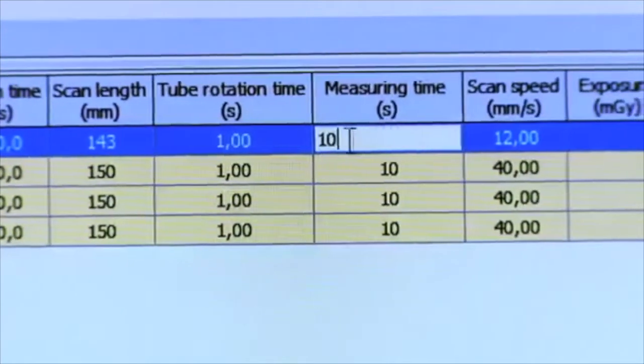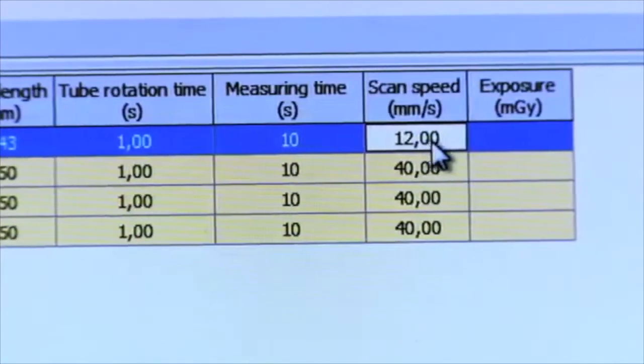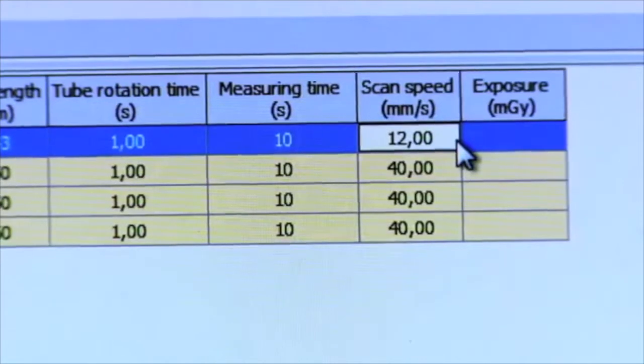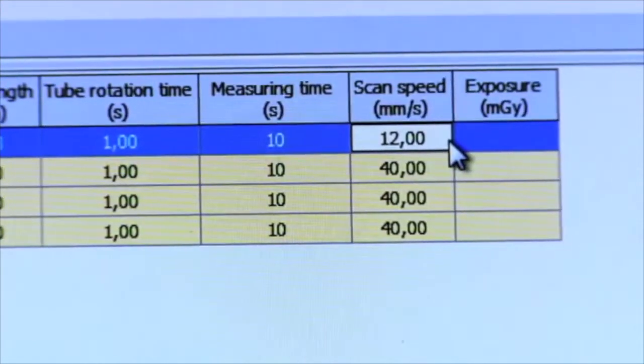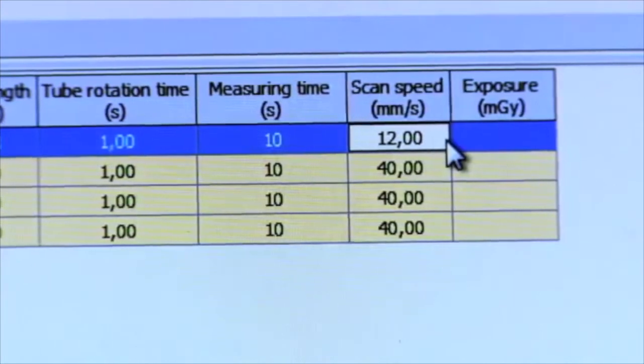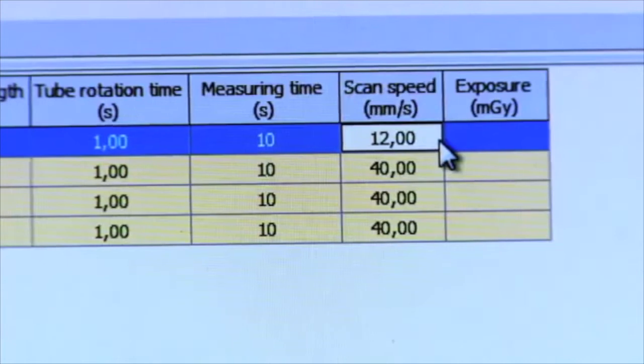Measuring time—this is the time it will take Ocean to collect the data from the measurement. This should cover the scan time. It is a good idea to choose parameters that shorten the scan time, for example, by selecting a higher pitch. When all parameters have been added, Ocean will automatically calculate the scan speed.